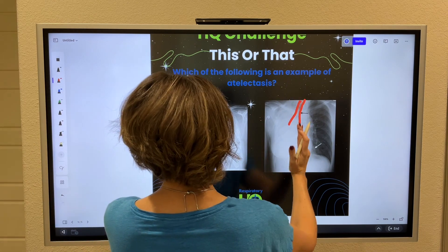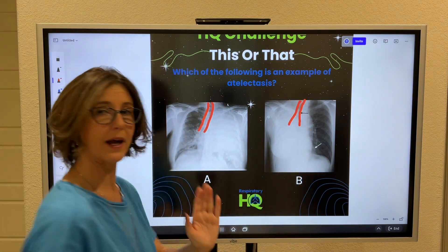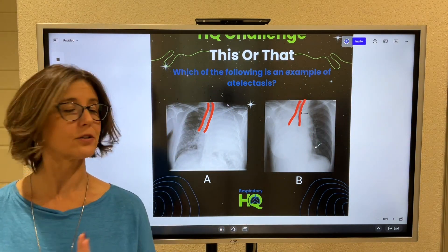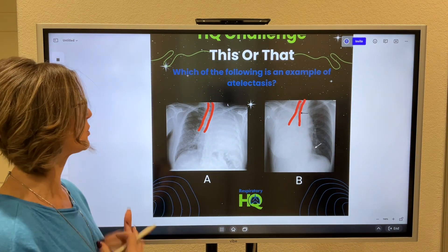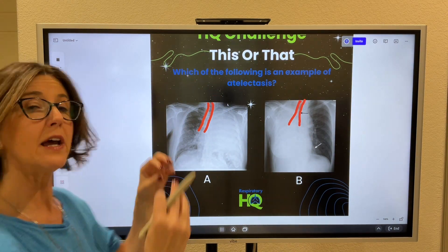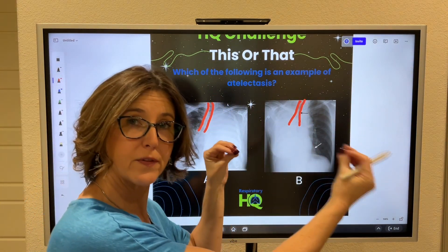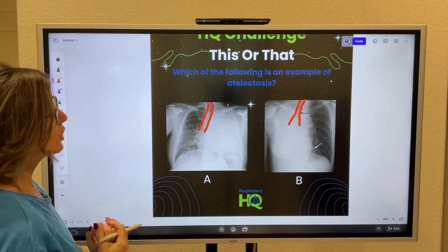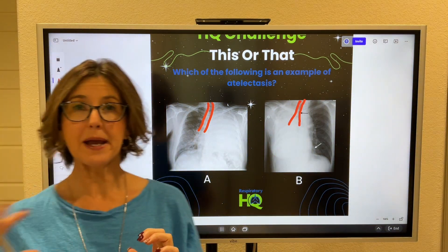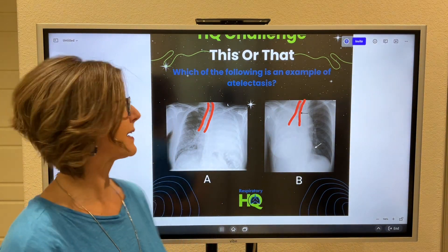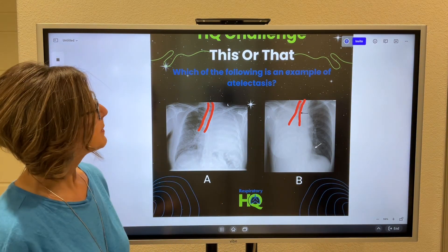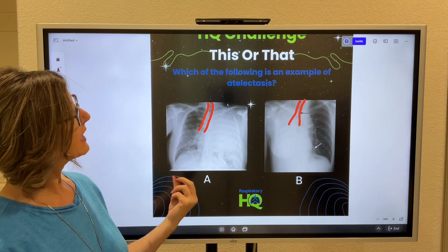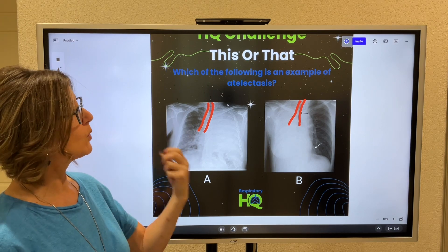Because if it was midline, it would be right in the center of the spine between the clavicles. So both of these have shifted to the patient's right side. But I'm specifically asking which one of these is atelectasis.